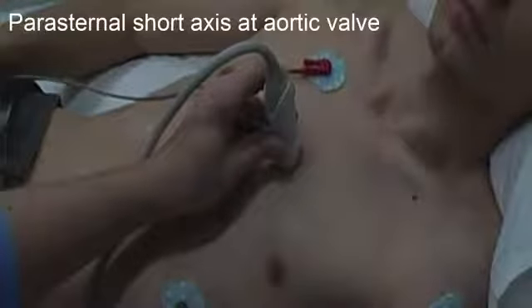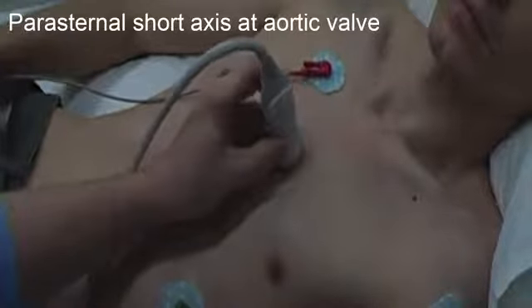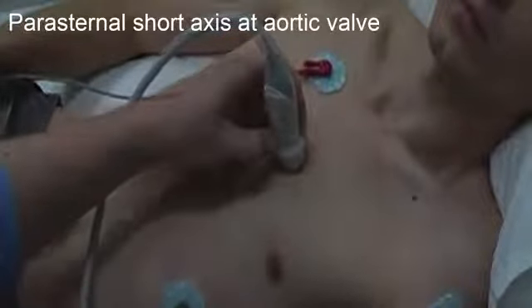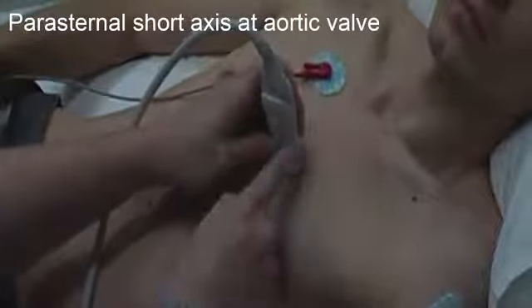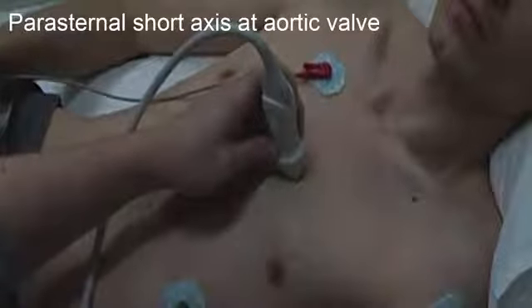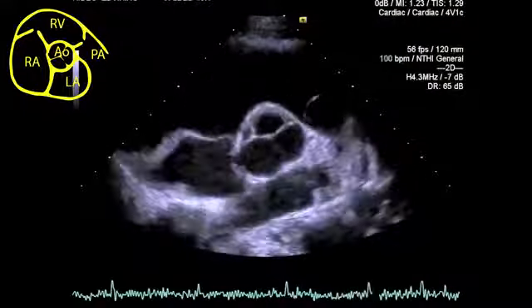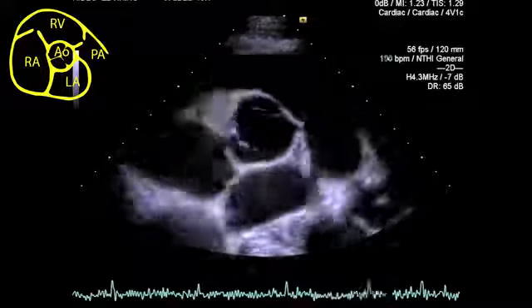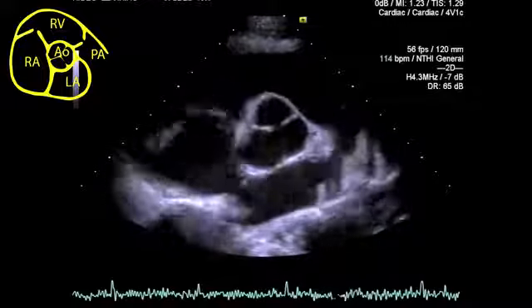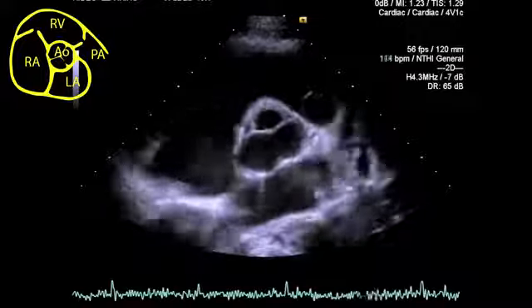The next view is a parasternal short axis view at the level of the aortic valve. From the long axis, rotate the probe clockwise through 90 degrees with the probe marker pointing towards the patient's left shoulder. You should first see the level of the aortic valve on a short axis, and have a look for that Mercedes-Benz sign in a tricuspid aortic valve. You'll also see the right ventricular inflow and right ventricular outflow wrap around the aortic valve.